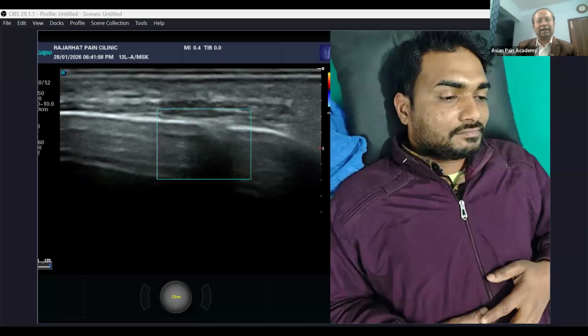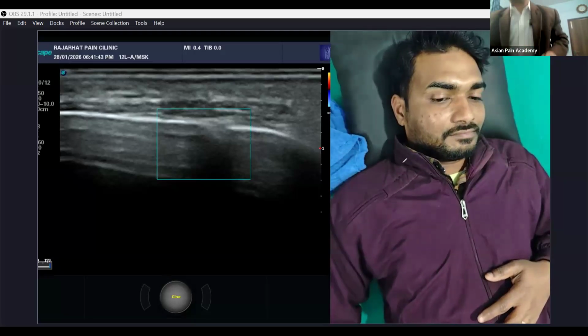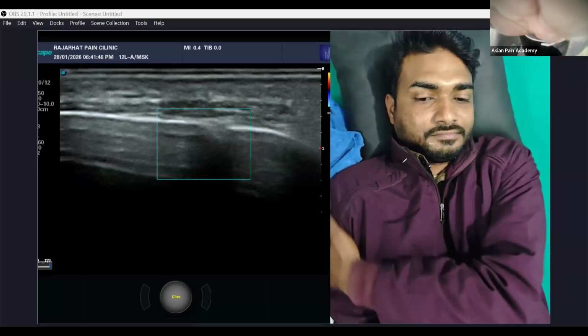Here, what I am saying is, as soon as you find the location of the foramen, then it is less than 1 centimeter, 0.5 centimeter, so what is in plane or out of plane, everything is the same here. You can go directly, your needle tip is entering the foramen, you will just feel it. Sir, and a regular needle only we'll use? Yeah, normal 5 cc needle. Okay, so this much only. Then we will go with the next part.